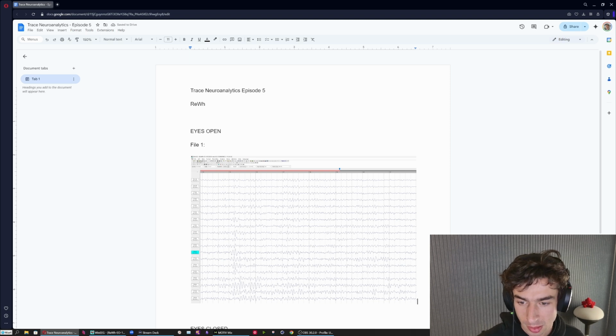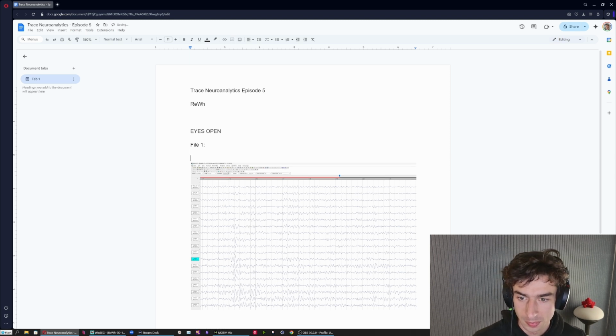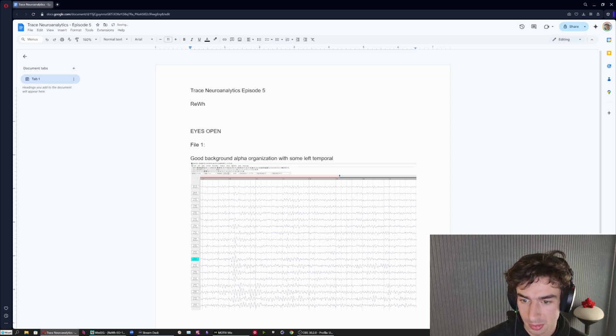And how would we describe this? Well, good background alpha organization with some left temporal alpha excess, let's say.